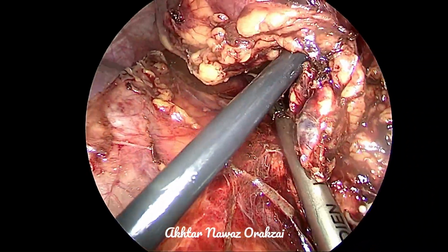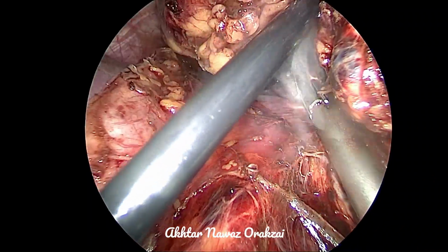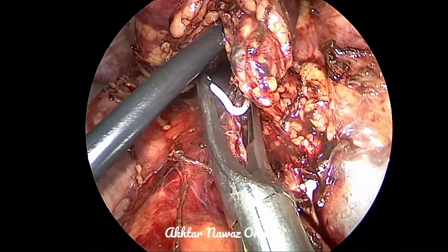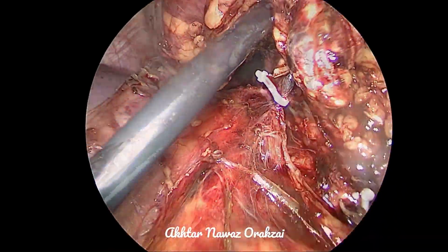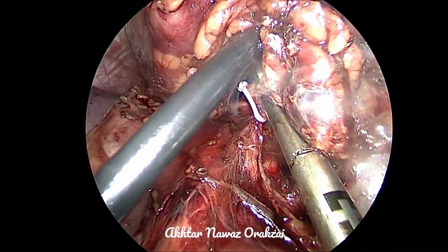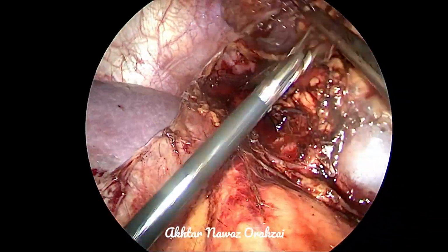We further thin out this tissue, and finally there will be just one stalk, and we just clip it and then divide it with scissor or with ligation, and so the adrenal gland will be completely free.